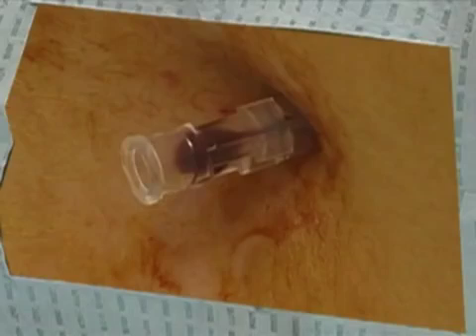In this case, you should obtain a new needle and enter the site through a different interspace.